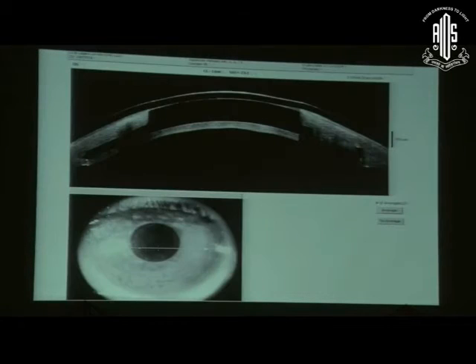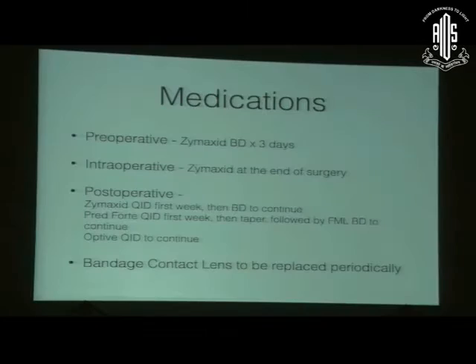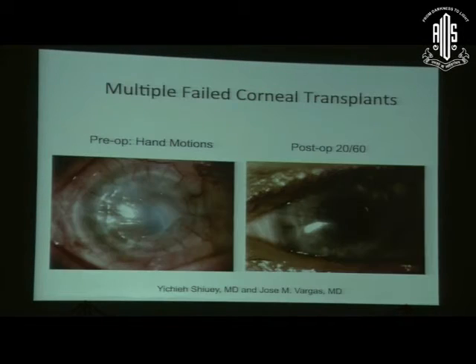One edge of the flange can be introduced into the pocket, and then you have a device, basically like pulling a tire onto a wheel. So it's something similar to that. You can introduce that. So that's what it looked like post-operatively, and that's on OCT. This patient did well. He improved up to 6/9, and he had a refractive error of about 9 diopters, so we had to give him a soft contact lens, put him on topical antibiotics, which he needs to continue long term, and a bandage contact lens to be there.